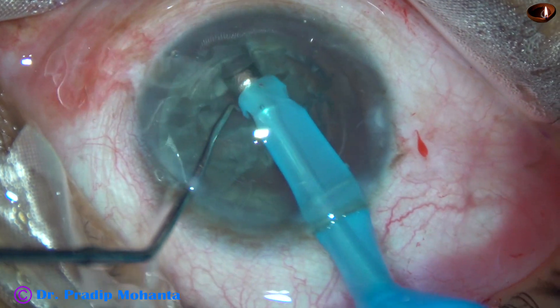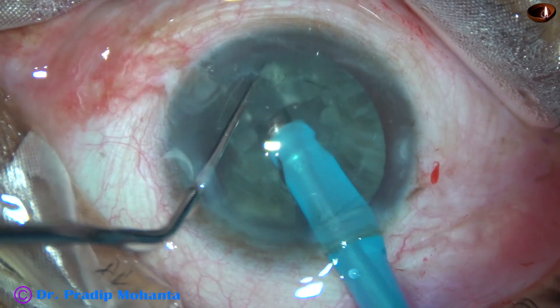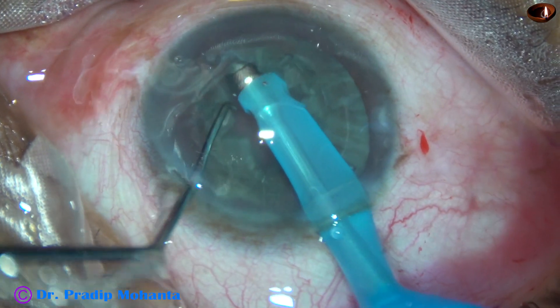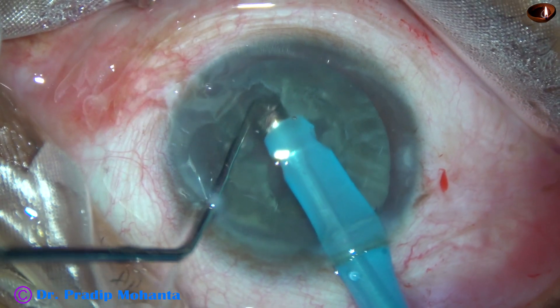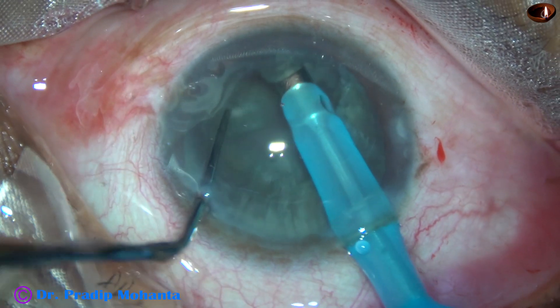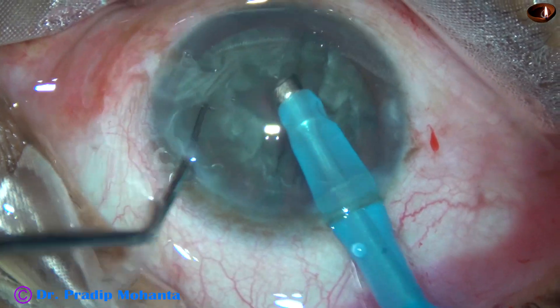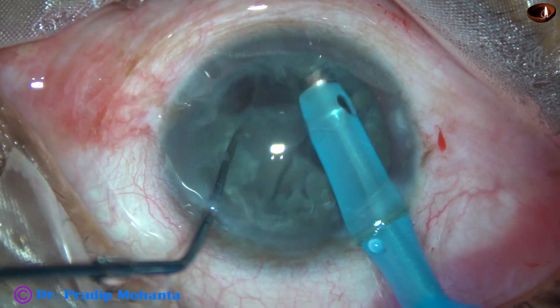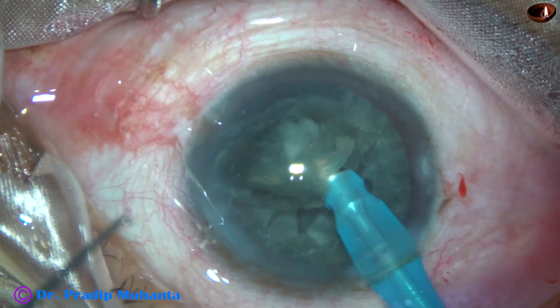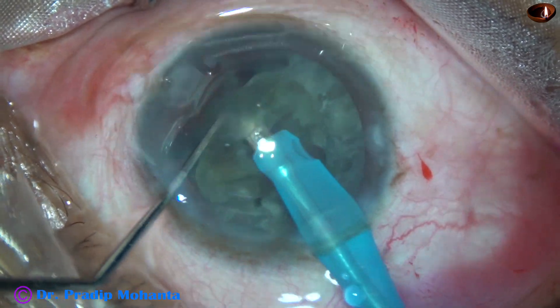The depth of these trenches should be about 80 to 90%. You should see the faint red glow at the floor of the trenches, and then you start separating the pieces. Go to the bottom of the floor and then apply opposing forces.